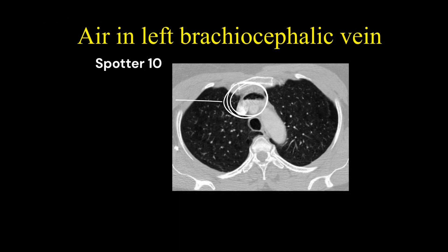You can see air in the left brachiocephalic vein, which joins the SVC. The most common cause will be iatrogenic.